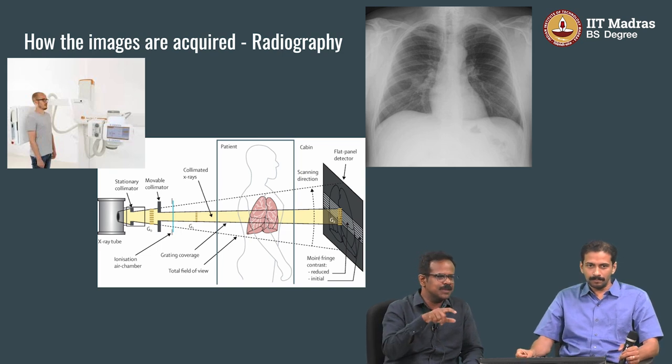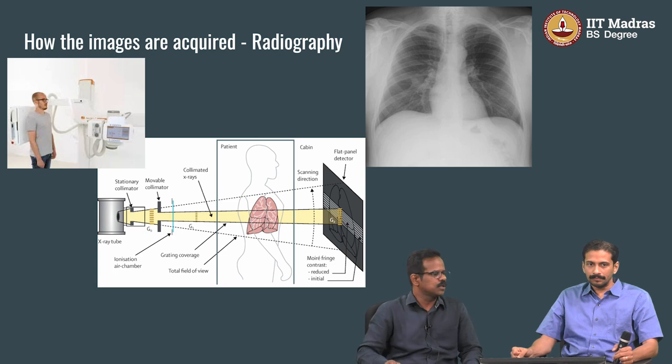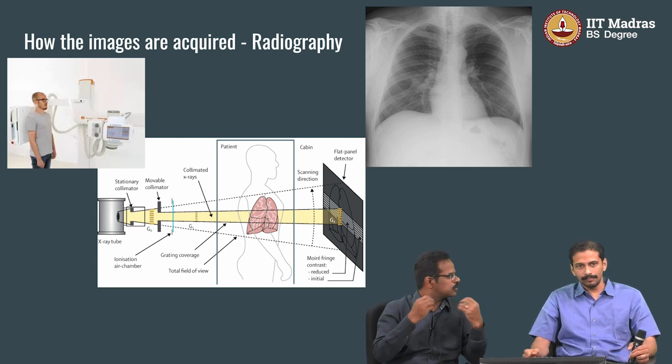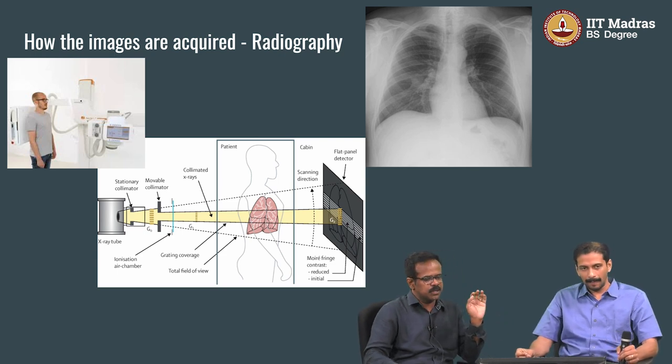Sometimes you change the aperture. But X-ray you cannot take repeatedly, so you have to adjust one thing. As you said, most of the systems pass a test ray, judge the thickness, then automatically calibrate the values, almost all the systems. Yes. Okay, so the intelligent systems are in place.